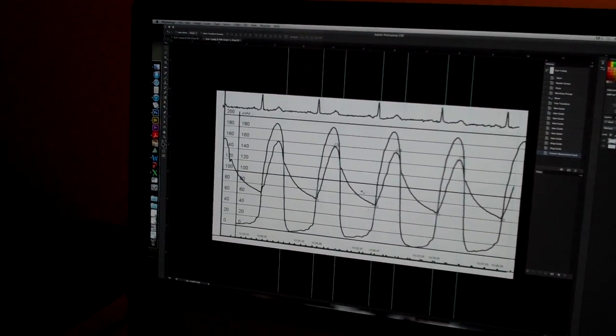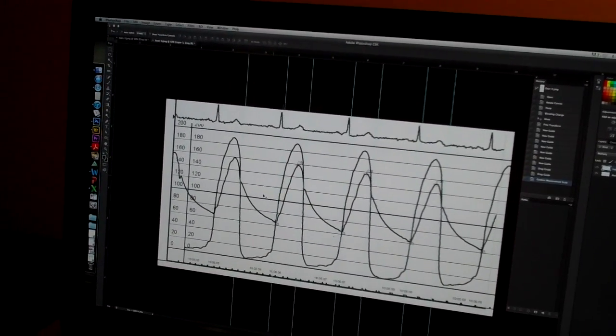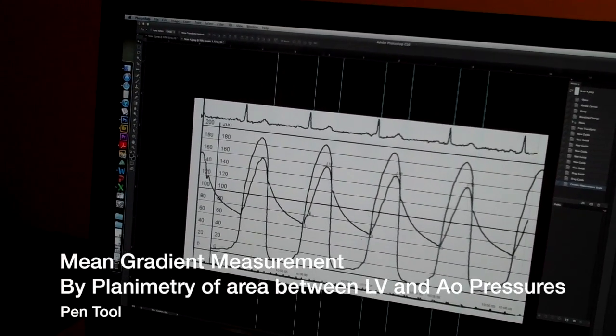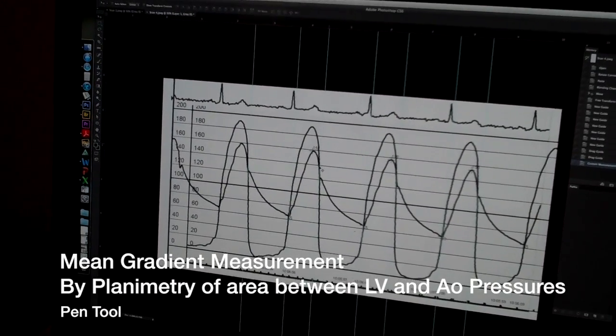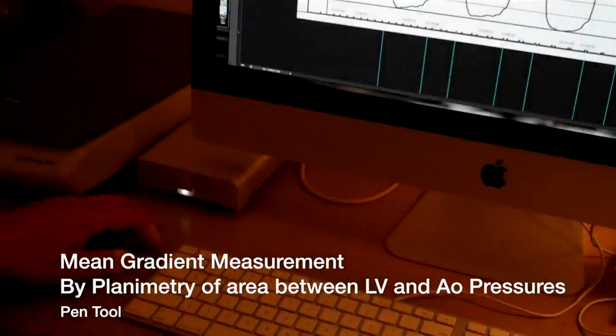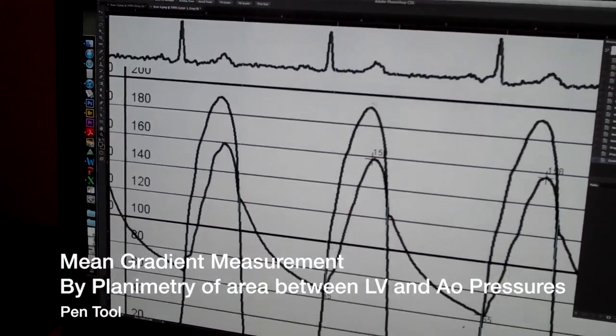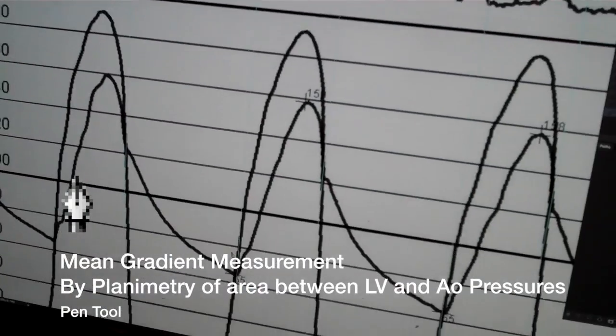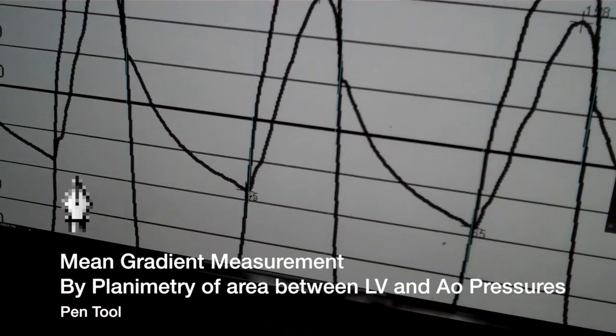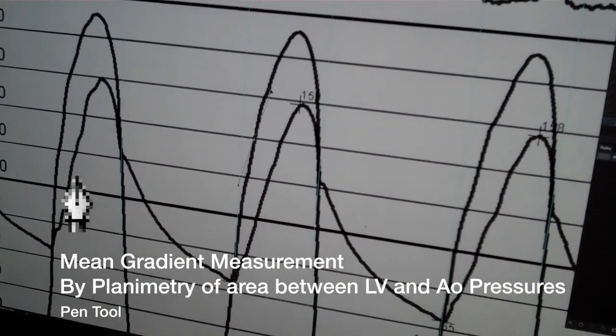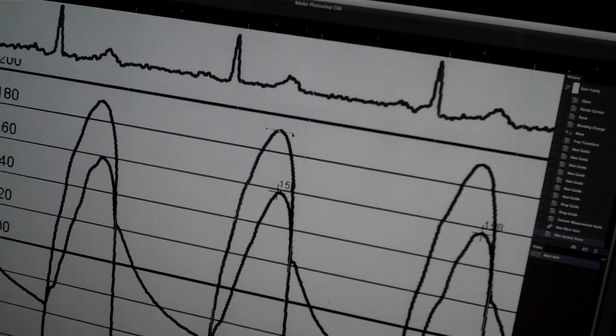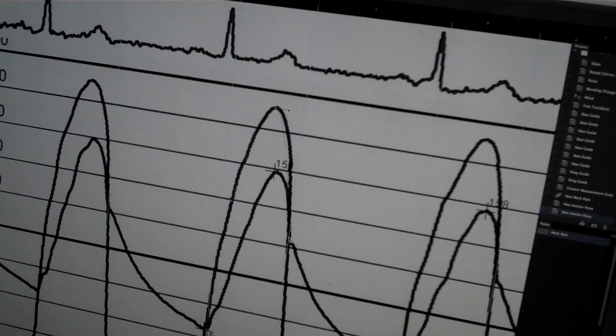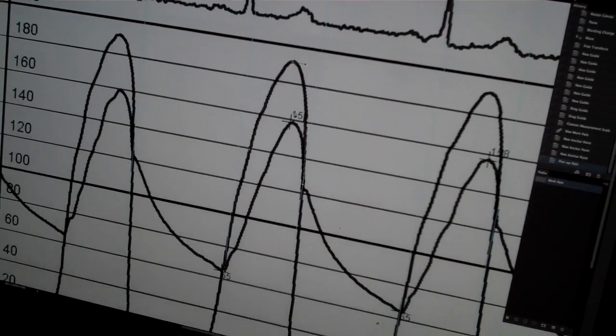So the logical length here is in centimeters. So that means that this 1176 pixels on the screen represents 9.9 centimeters on the actual paper. And that's the only time I need to do this. And I click OK. So now it knows anything I measure on the computer here will be converted to the appropriate number of centimeters. So the first thing I need to measure is the area between, circumscribed by this first beat. So I'm going to go back to the Z key and make this bigger a couple of times so that I can see it well.